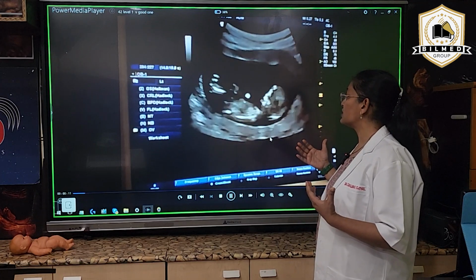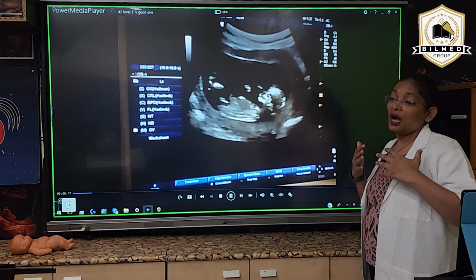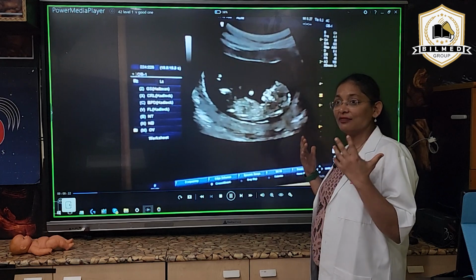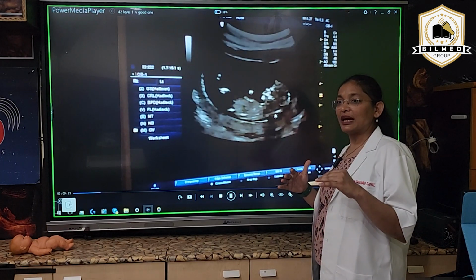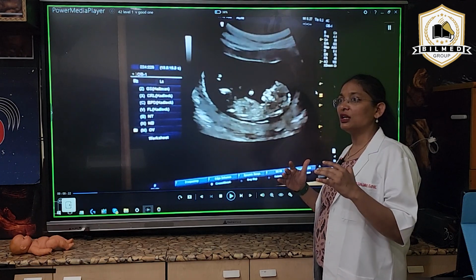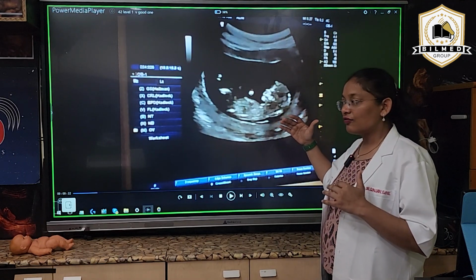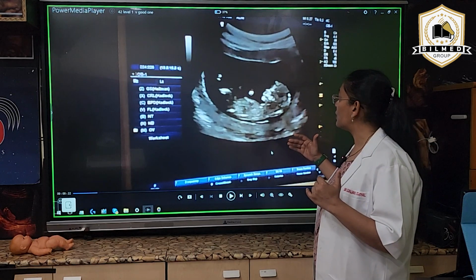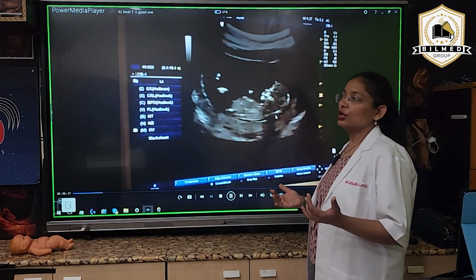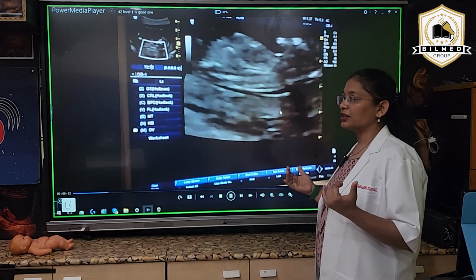And the next very important thing which is taken is ductus venosus. As you have studied the fetal circulation, and our Doppler courses also show what the ductus venosus is. When the umbilical vein joins the IVC, before that a structure comes, that is the ductus venosus. It is a narrow structure which increases the velocity of the flow. So any reversal of waves or any type of abnormality in the ductus venosus indicates cardiac defects. So this was in brief about all the components of nuchal translucency.